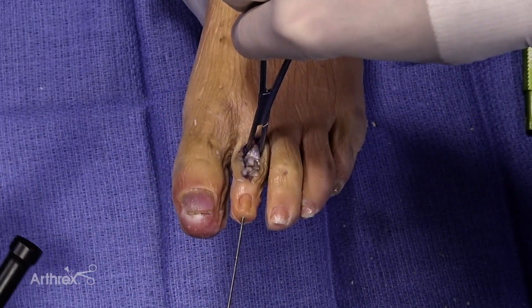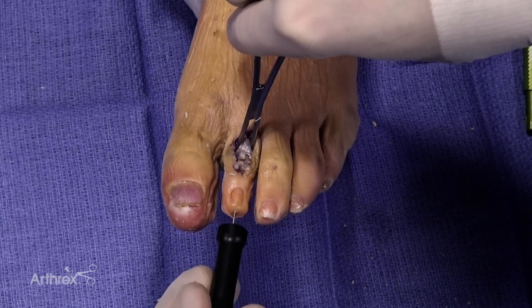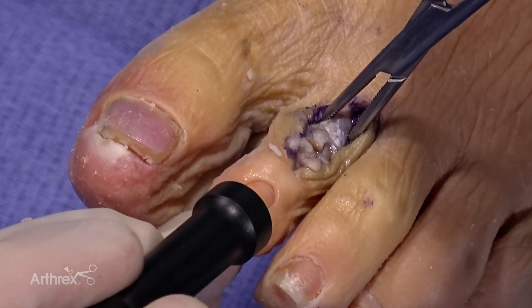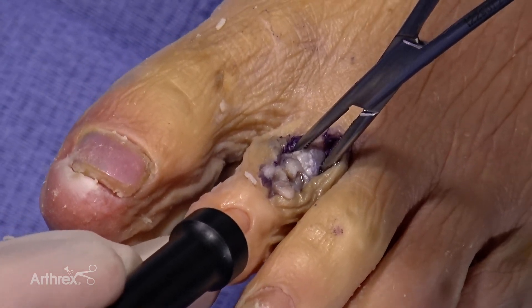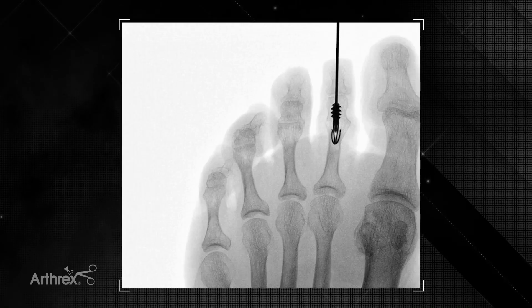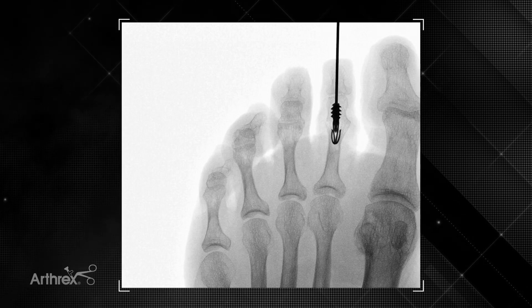Now we're going to use the toe tamp, and at this point we want to make sure that the implant is well seated, so we're going to lightly impact here. I'll hold on the far side on the proximal phalanx, and then the assistant will go ahead and apply some gentle tapping to bring the fusion site together, and then we'll confirm that under fluoro. The key here is to make sure that the barbs have fully inserted into the proximal phalanx and that they're capturing the bone. If not, you can use the toe tamp to make sure that the fusion has been well seated.